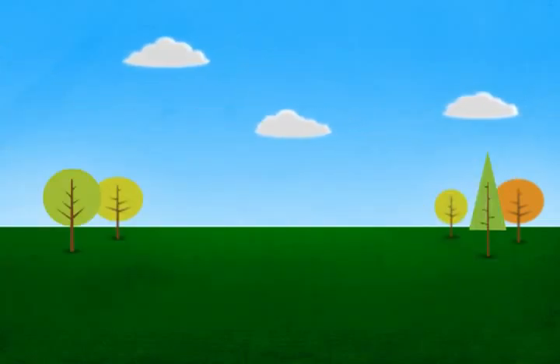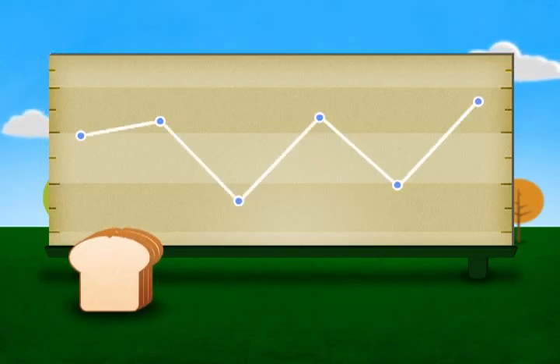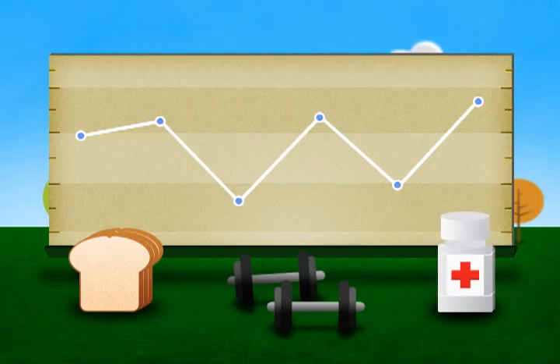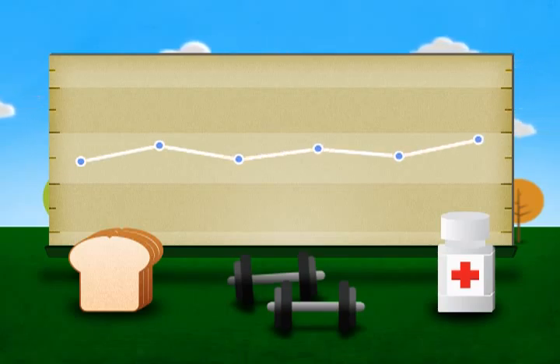For instance, by examining glycemic variability data along with a diet and exercise log, your healthcare team can determine how diet, exercise, and medication affects your daily blood glucose levels and make adjustments to ensure your data clusters are more tightly grouped. As a result, you may feel more active, less fatigued. In other words, you may feel more normal again.